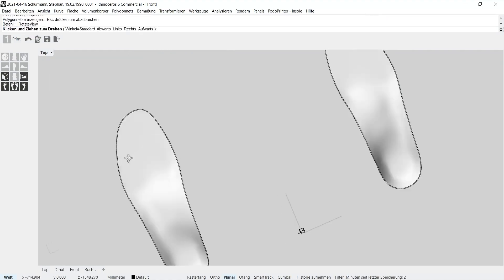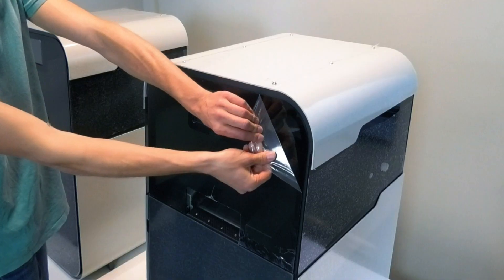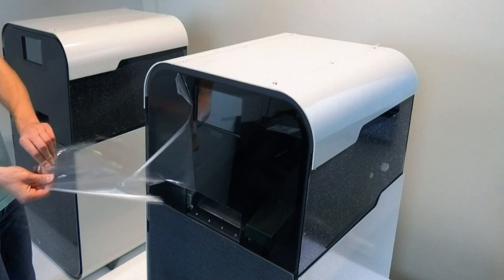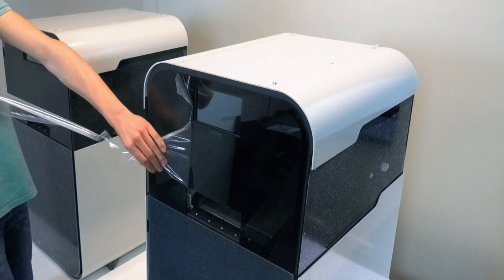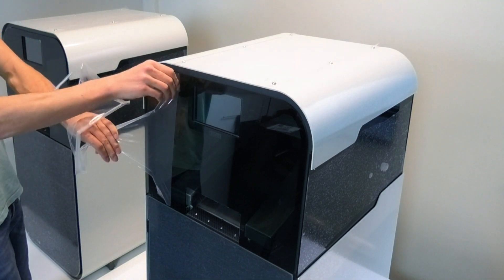The insole is now ready to print, but first let's have a look at the setup of the printer.